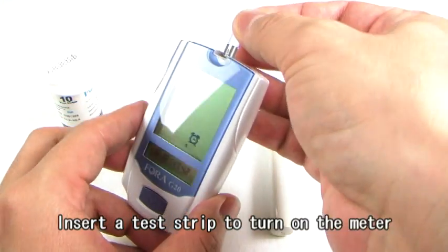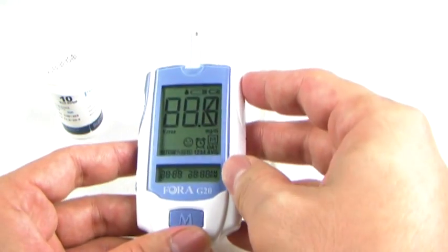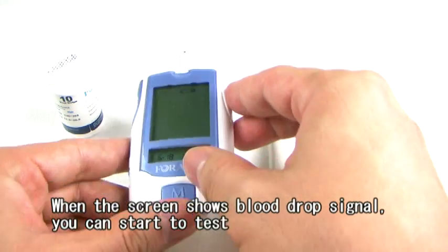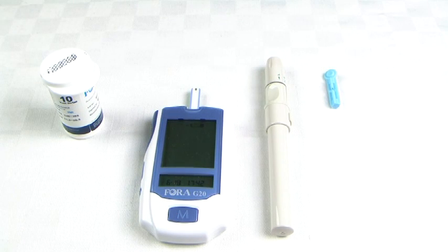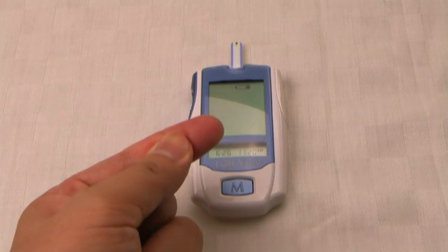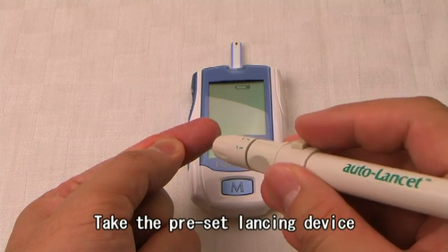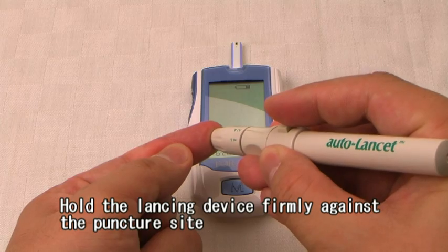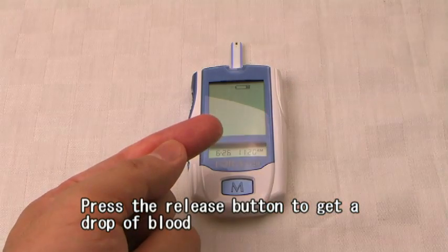Insert a test strip to turn on the meter. When the screen shows the blood drop signal, you can start to test. Take the preset lancing device, hold it firmly against the puncture site, and press the release button to get a drop of blood.